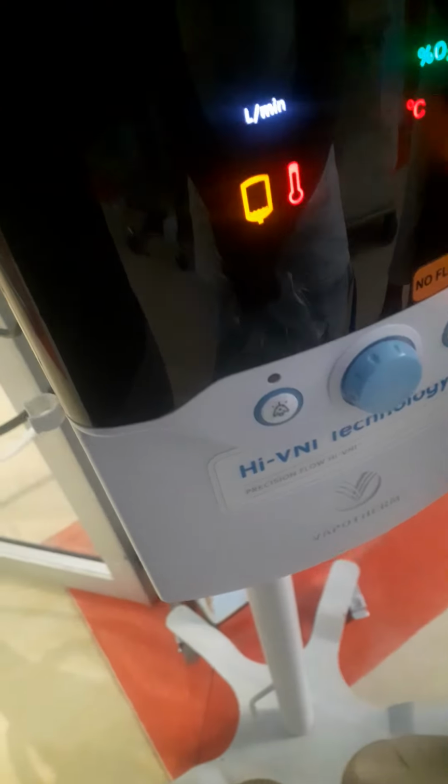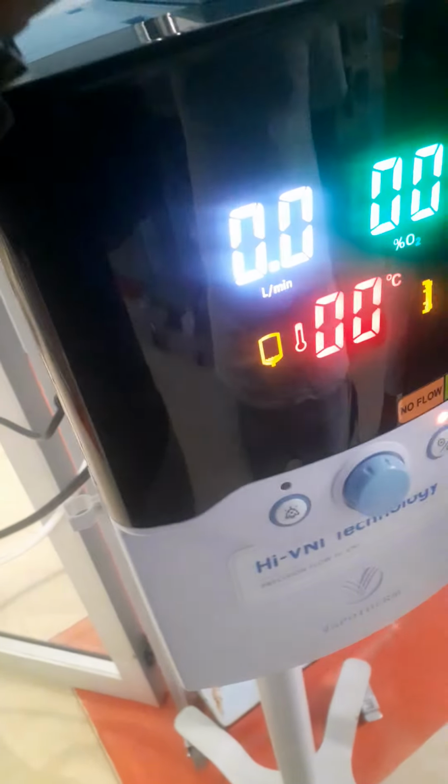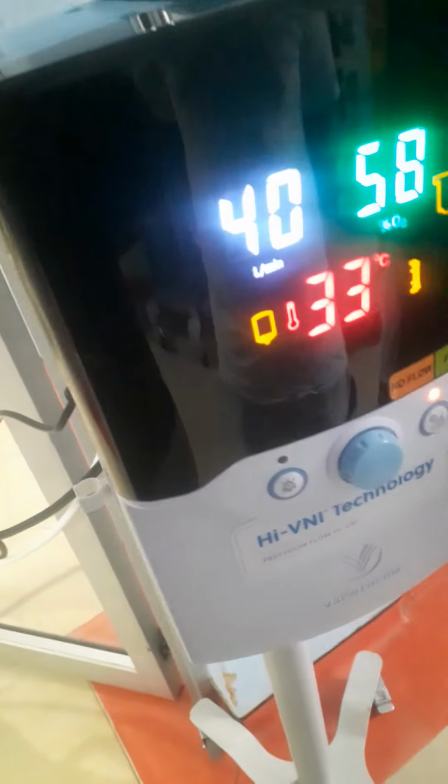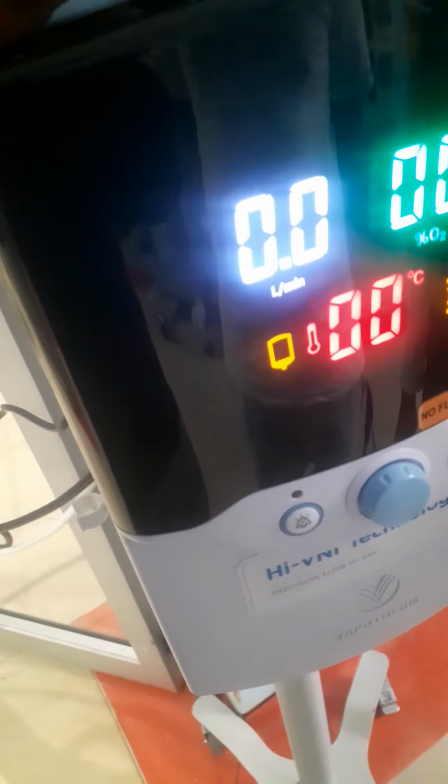And also the oxygen. Remember those oxygen devices have oxygen content that they give, like the Venturi mask. Yes, exactly. The Venturi masks come with colors, the yellow, green, blue, and so on, and it indicates the number of flows and the oxygen it gives. Okay, I've seen that one.